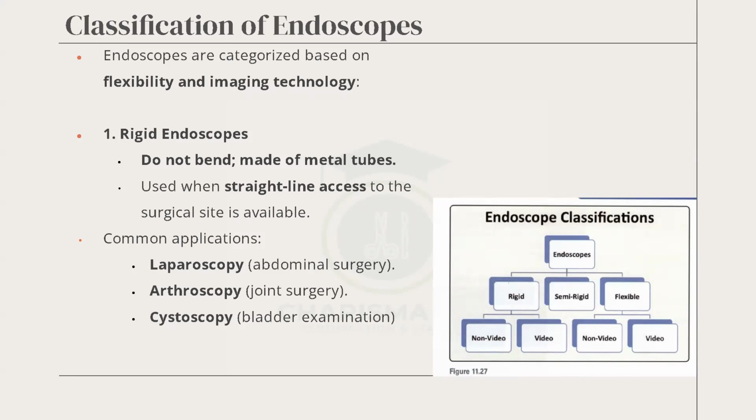Common applications: laparoscopic, which are the abdominal surgeries. We have arthroscopy, which is joint surgery. That is, arthroscopy has to do with ortho. Then cystoscopy has to do with your bladder. Every human being has a bladder, and please make sure you don't damage your bladder by keeping it full for a very long time. You can even pass out.